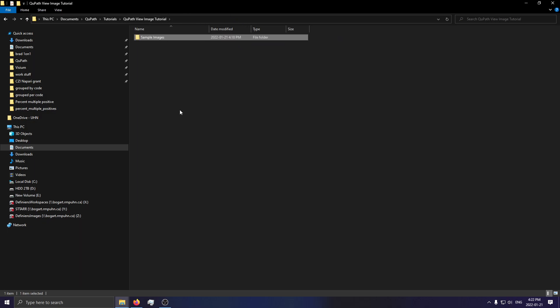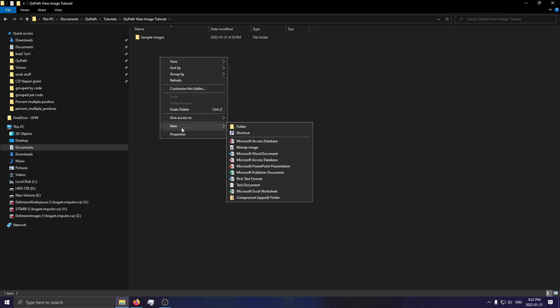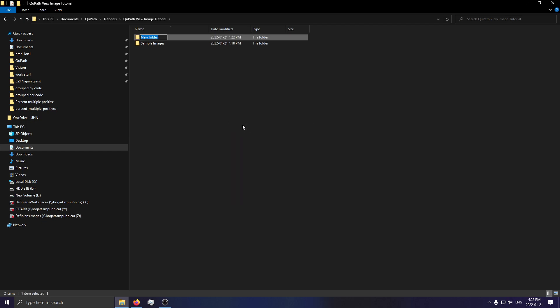The next thing you want to do is to create a new folder. This folder will be for something called your QuPath project. This is a database of where your images are located and what viewing settings you had last saved on them. We'll call this "sample project".